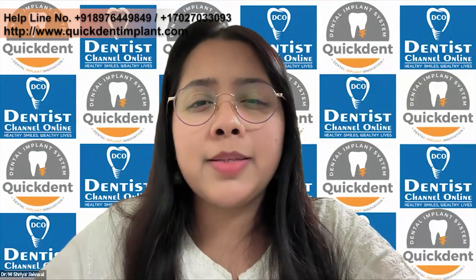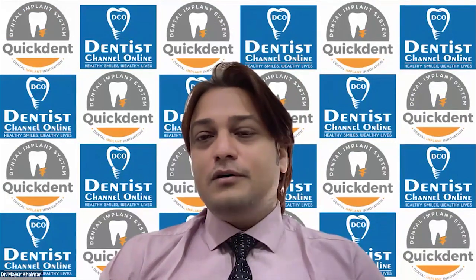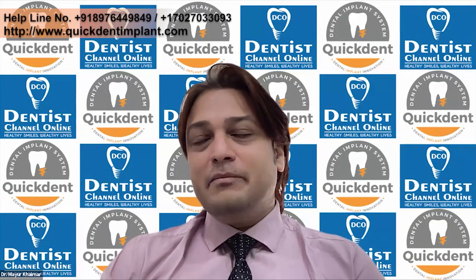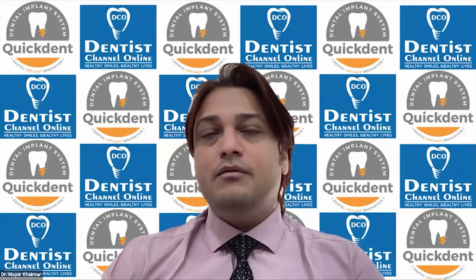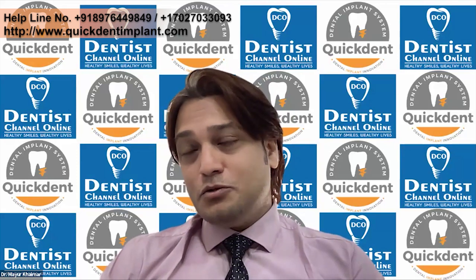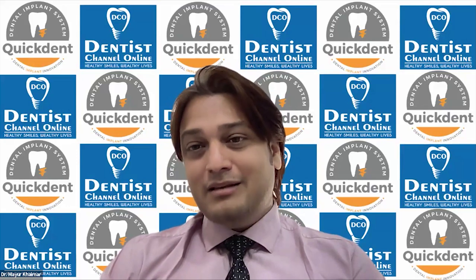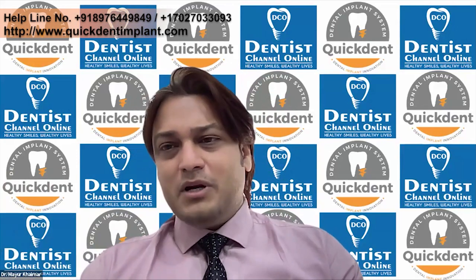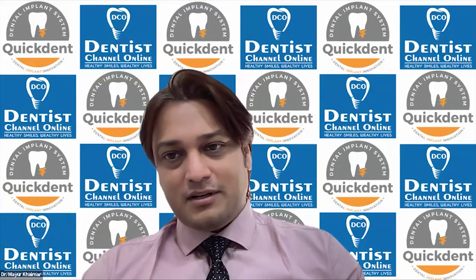Hi, what material has been used for surgical guide through lab? Hi, Dr. Sonali. This depends. You can get a surgical guide made out of metal, that is cobalt chromium. You can also get it milled out of resins. Which resin is used? I think they are all biocompatible resins. I don't know the name, but these are the same resins which are used for digital mockups, and their strength is quite good enough. The lab people are the right people to tell you this.